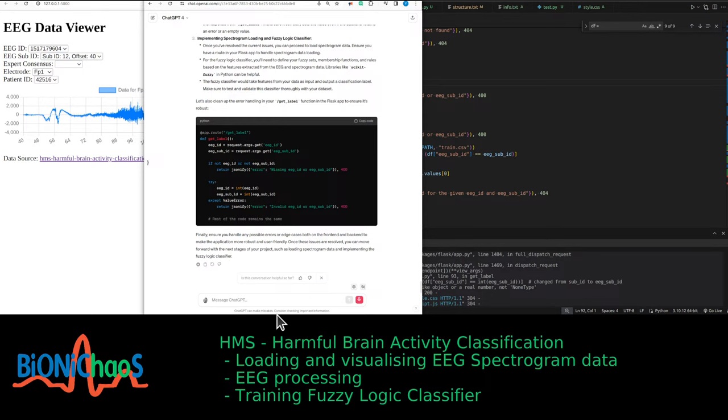It looks like you're encountering a 400 bad request error when calling /get_label, suggesting that either EEG ID or EEG sub ID is missing or invalid. Also, the expert consensus field is showing as undefined in your requests to /fetch_eeg_data, which might be related to the front end not handling the received data correctly. Let's address these issues step by step.